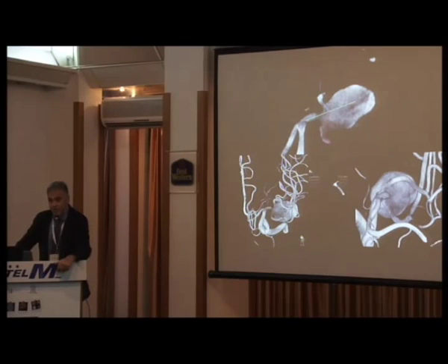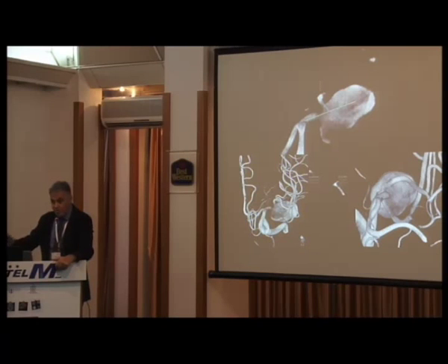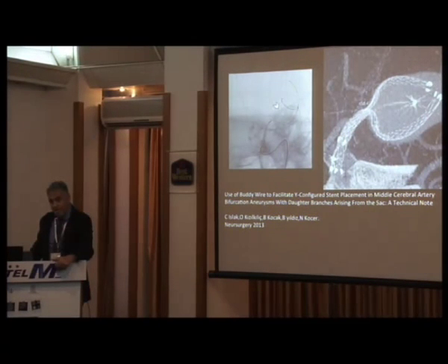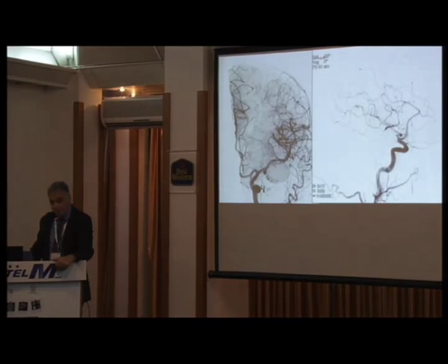And we improved ourselves by using other techniques. For example, that terrible angle, the branch of the MCA originating from the aneurysm at a different angle. Whenever you want to go to one branch, the whole system changes its position, and it is really difficult to go to the other one to create the Y stent, whatever technique you use. So we started to use the buddy wire as we used in carotid stenting or subclavian vertebral ostial stenting technique for MCA aneurysms. After using the buddy wire, you have a good stabilization to create that Y configuration and then have a good occlusion.